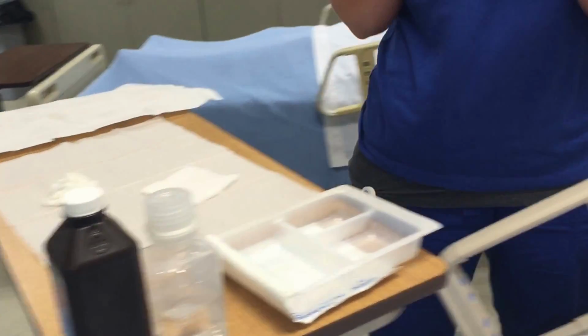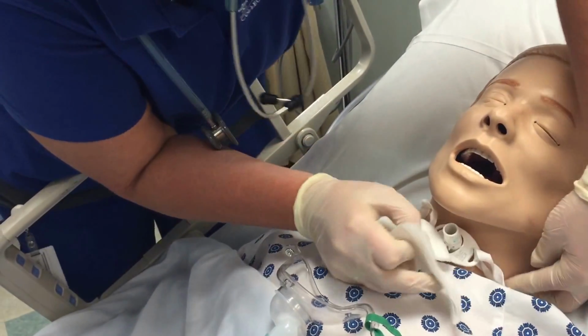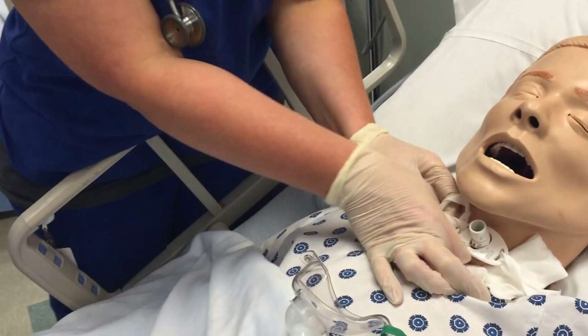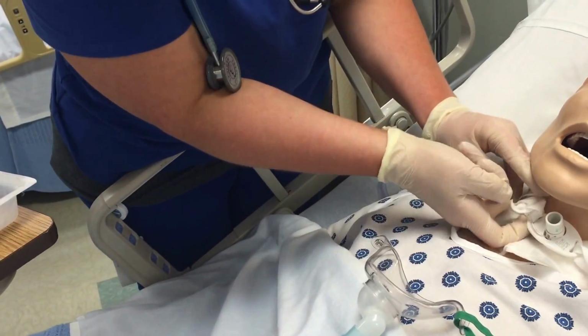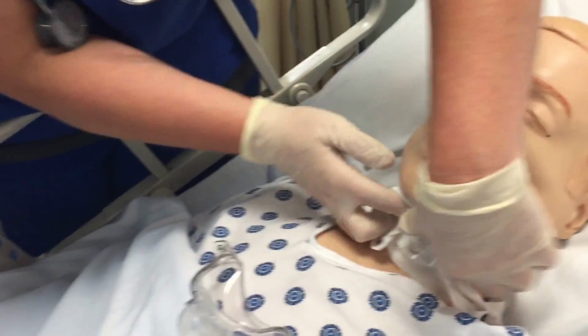Now, I'm going to take our drain sponge. All right, Miss Ann, we're going to go right up under your trach here. Sorry, sweetie. This part's a little uncomfortable sometimes because it tugs a little bit. Your patient may cough when you're doing this because you're kind of irritating that stoma. But hopefully where you've just suctioned them out, they won't cough anything out at you. But just be mindful of that.